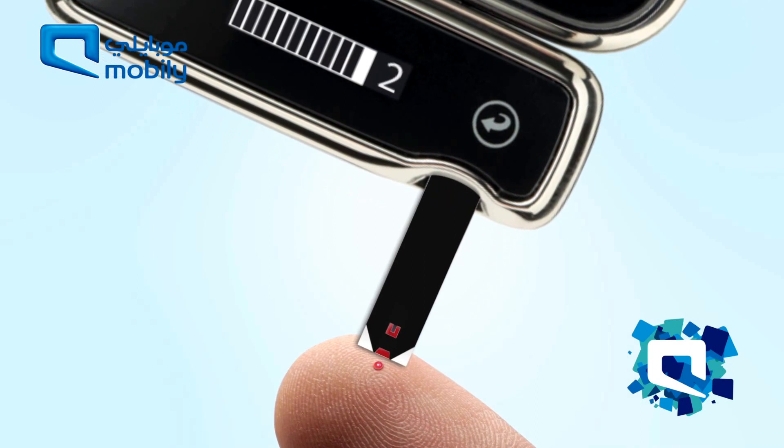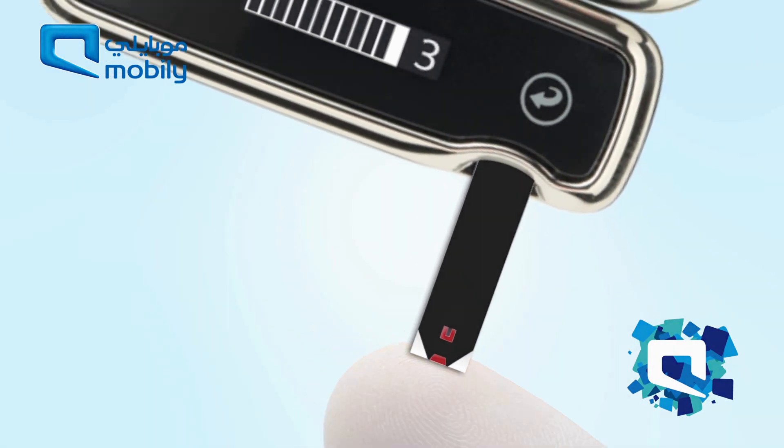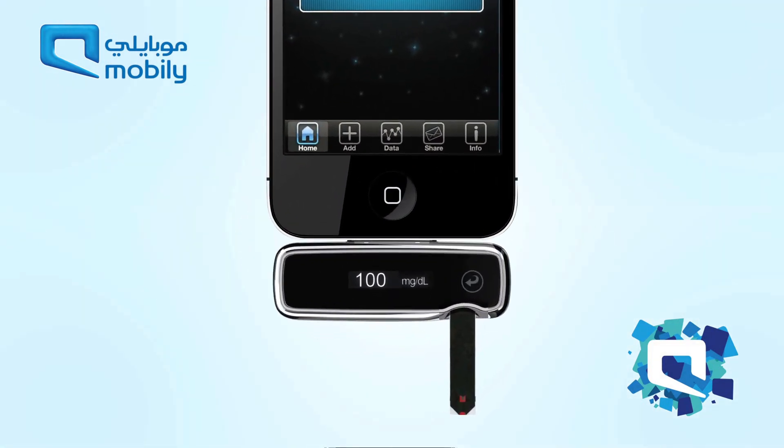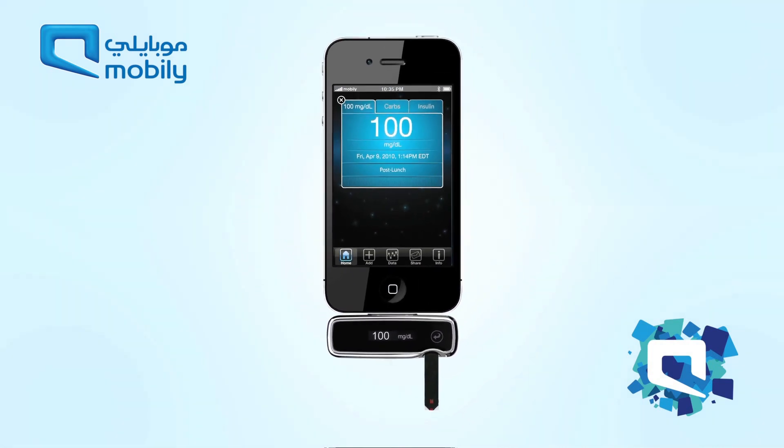Remove the test strip from the blood sample when the visual fill window turns completely red and the iPhone or iPod Touch beeps. The blood glucose reading will appear on the IBGSTAR's display and on the screen of the iPhone or iPod Touch.